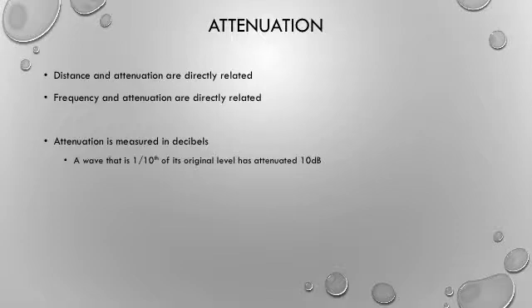Again, this is just restating our attenuation coefficient. So we've mentioned it, what, in 5 slides now? Maybe it's important. Okay.